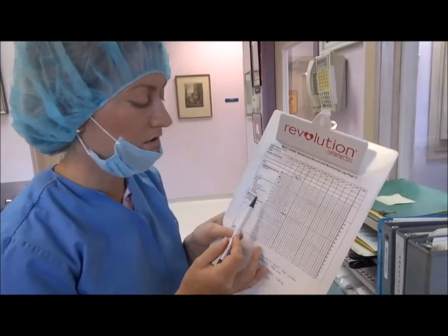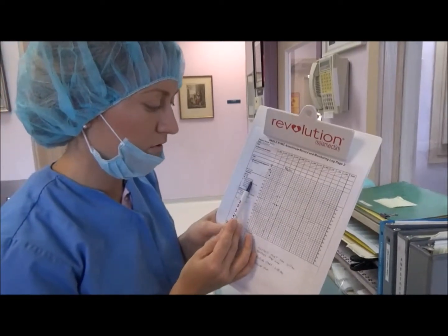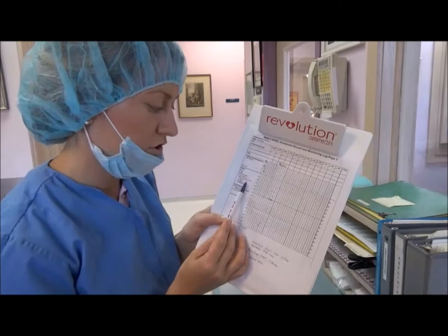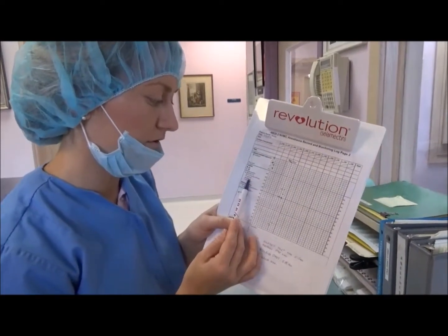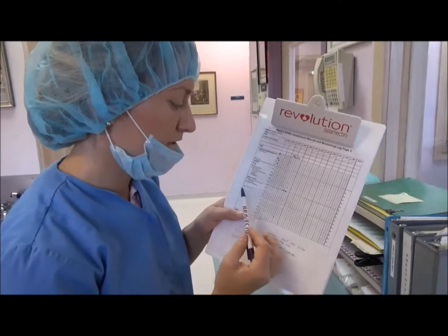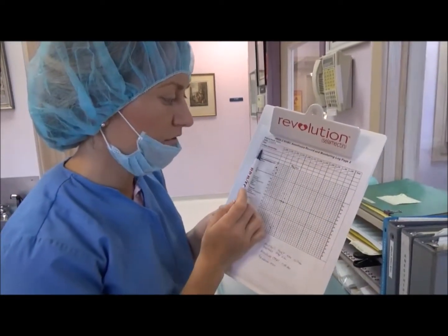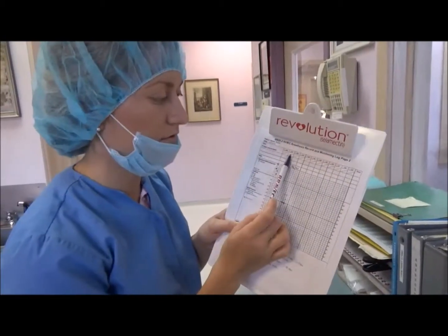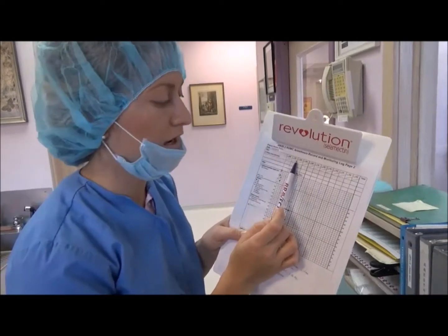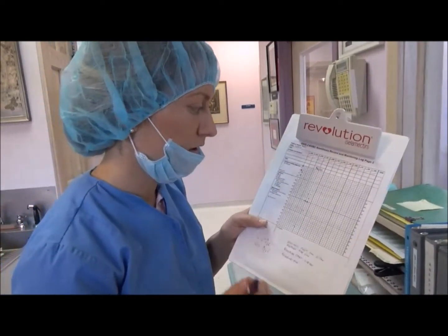Other things you want to chart, every 5 minutes you want to do heart rate, respiratory rate, pulse ox, end-tidal CO2 if you're using that, and then your blood pressure, noting the systolic, diastolic, and mean arterial pressure. Temperature, you chart about every 15 minutes. And if IV fluids were given, you would chart those every 15 minutes as well. You would chart the rate that you're going at, and then the running total as far as how much fluids they've gotten so far.